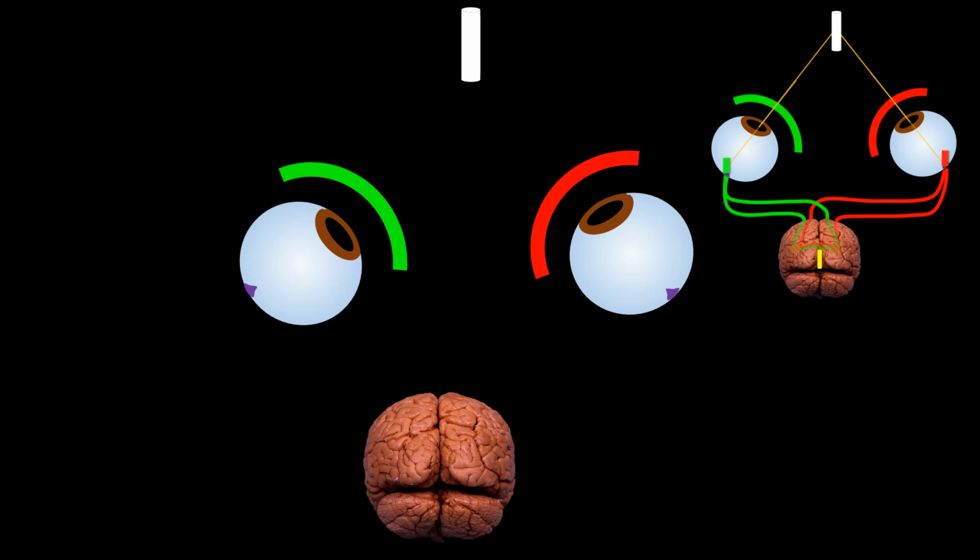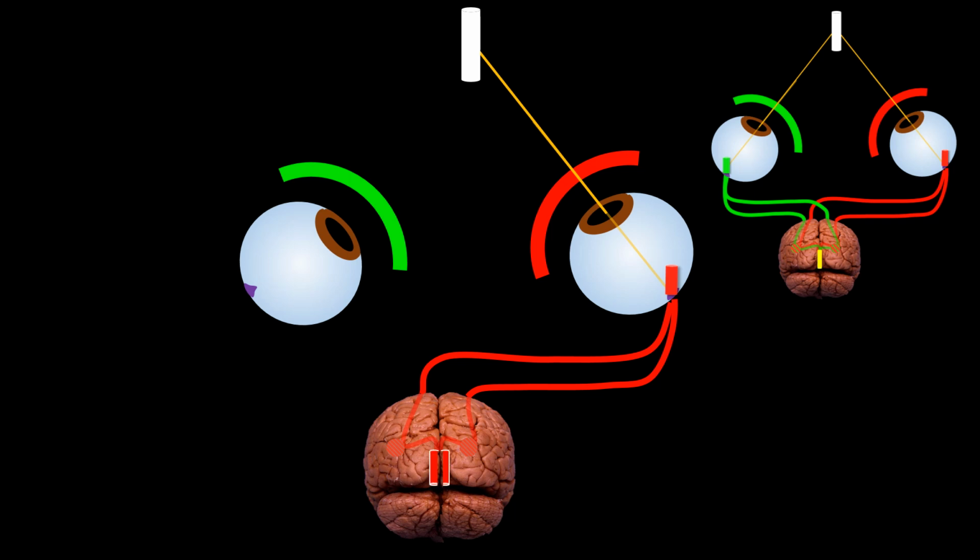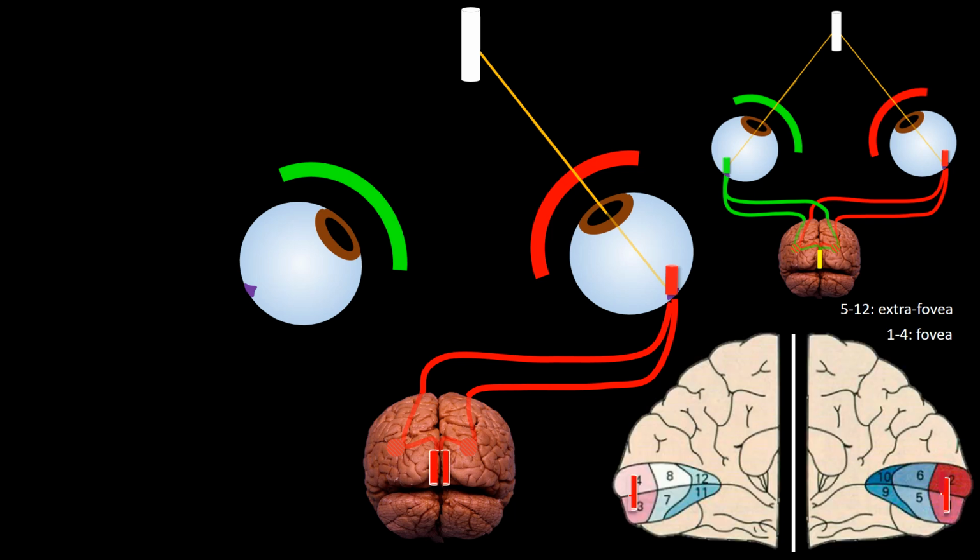In this frame, I have added the brain, eyes, white bar, and the representation of the Armstrong goggles, the green and red crystals. Now you can see the nasal and temporal foveal fibers from the normal right eye forming the optic pathway from the fovea macular region to the calcarine area. Hence, when viewing the white bar, the image will traverse the center of the cornea and fall in the fovea, where the red image will be captured, transformed into electricity, and transported to the calcarine cortex, as represented in the cartoonish representation of the brain.